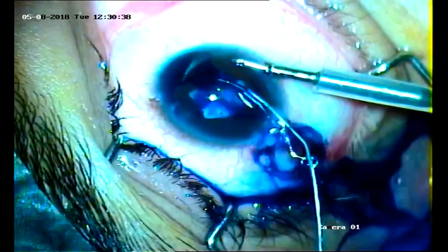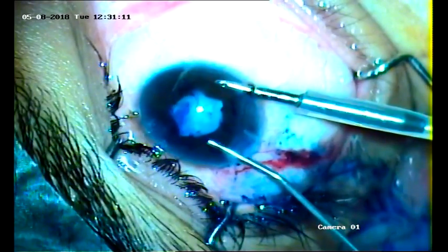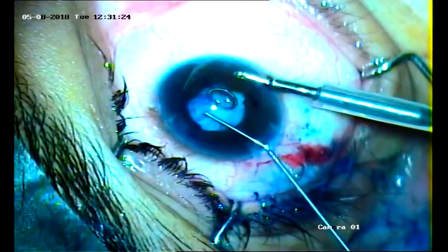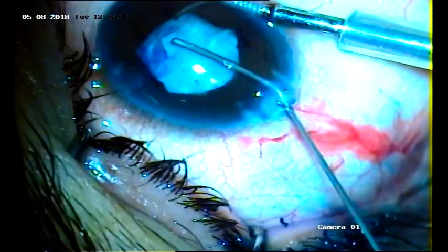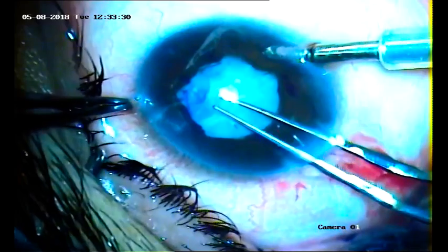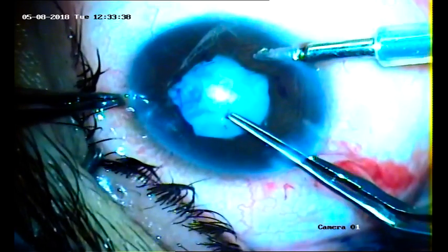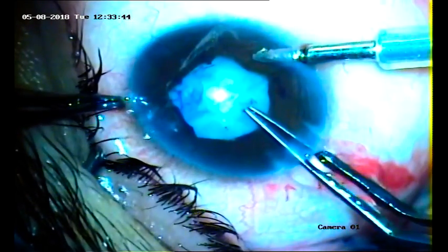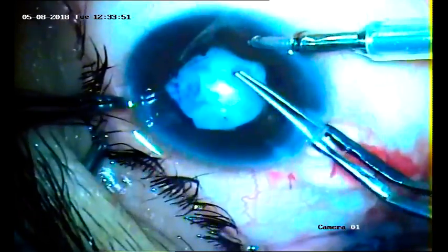As it is a white cataract, we used trypan blue to stain the anterior capsule. Again, high molecular weight Viscoat was used to dilate the pupil and also to protect the corneal endothelium. An AC maintainer was used for adequate depth of the anterior chamber, which infuses 2% HPMC viscoelastic as and when necessary, to protect the corneal endothelium and to maintain the anterior chamber. A visco-filled syringe is applied to the AC maintainer.